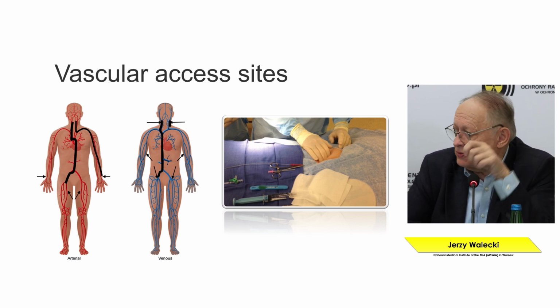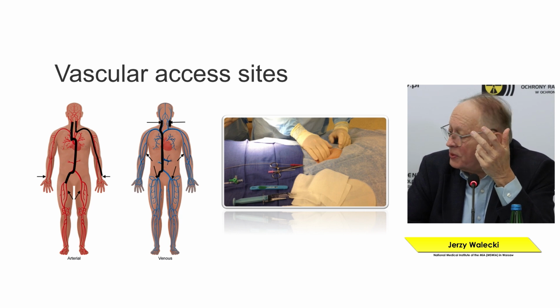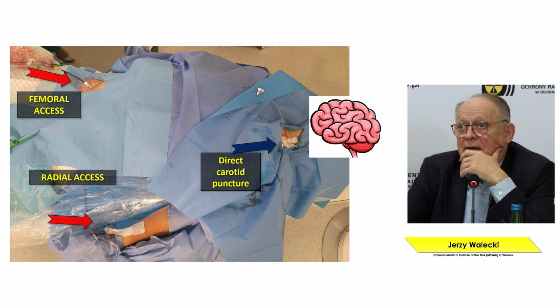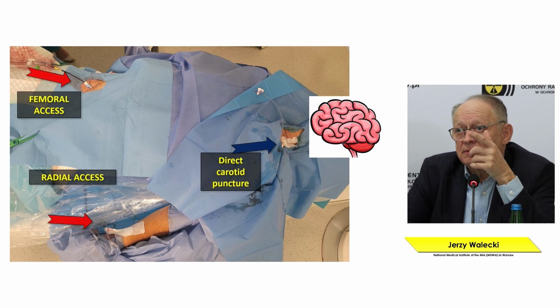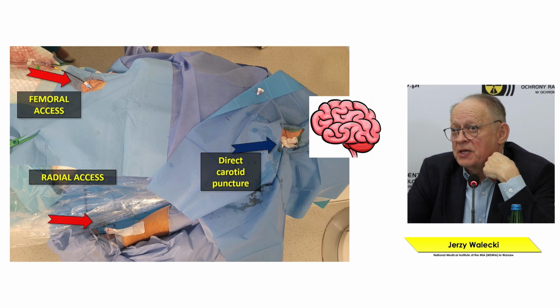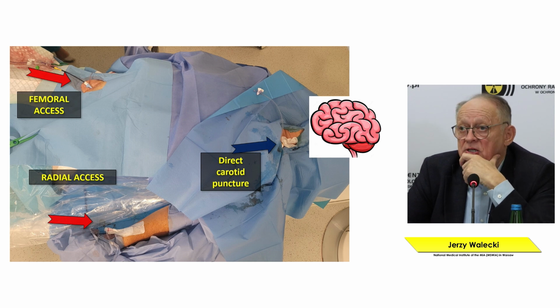So, not mentioning complications, sometimes mechanical injuries. So it's not so easy and rosy. So these are access points, femoral access, carotid, direct carotid puncture, or radial access.